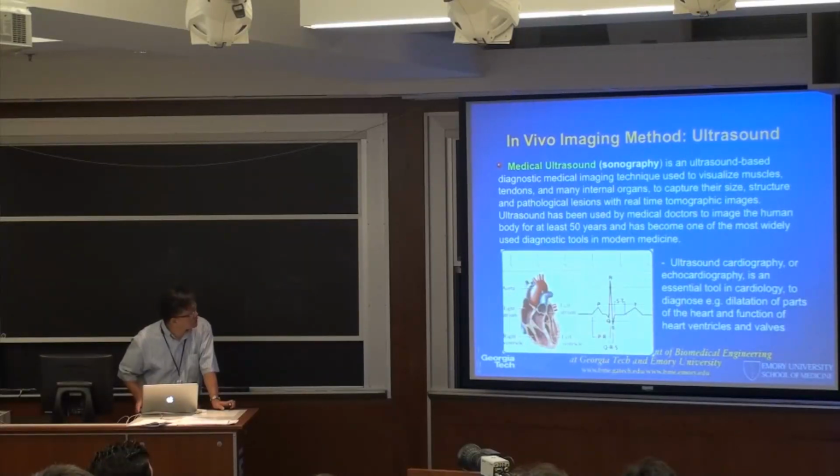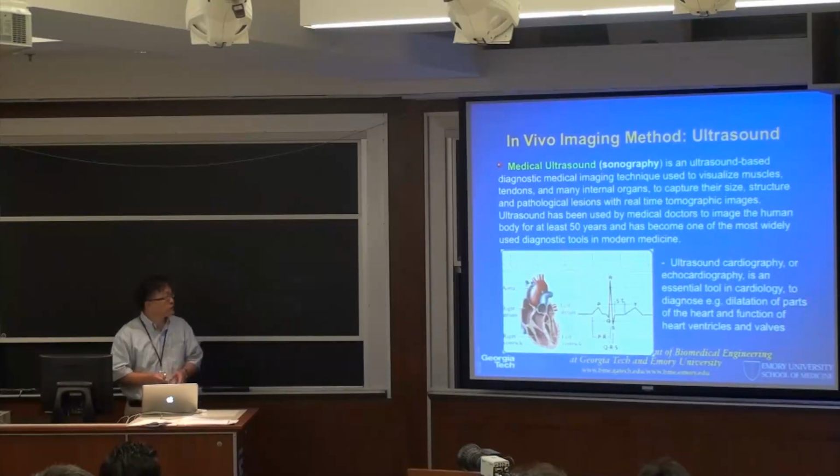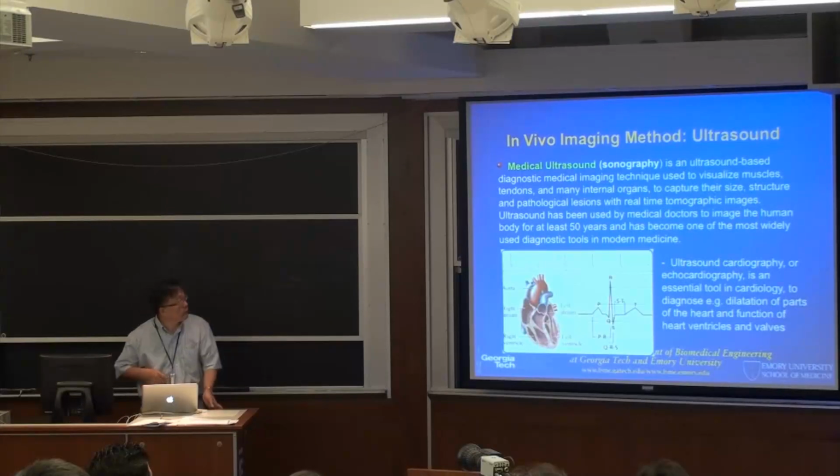So ultrasound, as I mentioned quickly, of course, is well known. A lot of different applications. In addition to evaluating the health of the unborn baby, another very important application is in cardiology, so-called ultrasound cardiography or echocardiography. Of course, I would assume quite a few of you have used this, or the doctors have used this to evaluate the health of your heart, right? So that's mostly used in hospitals, in clinics.